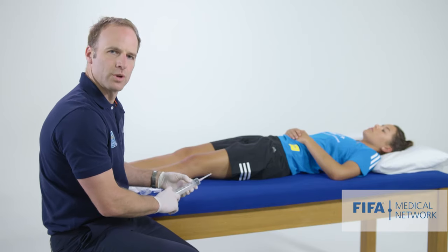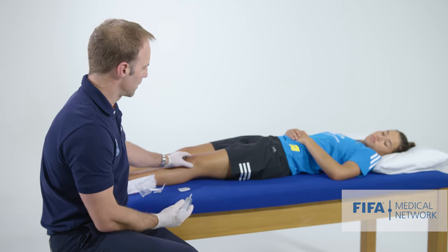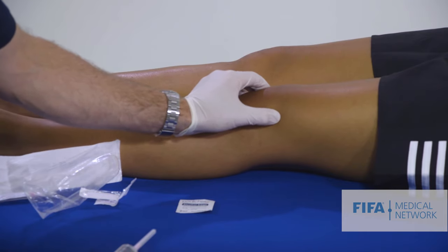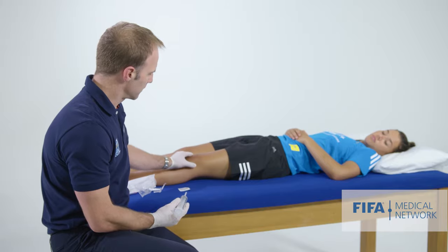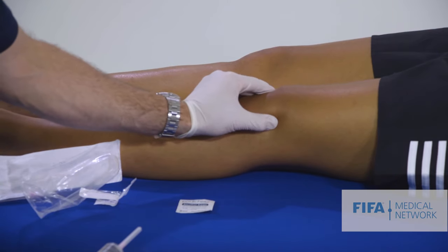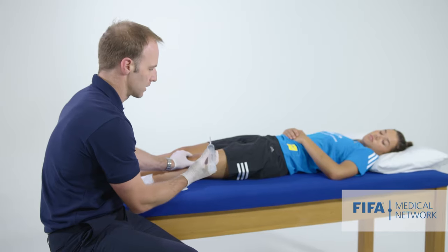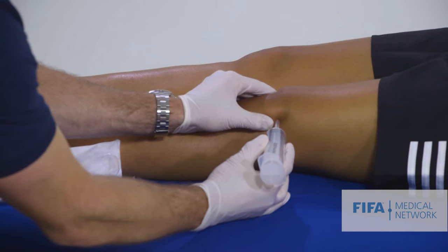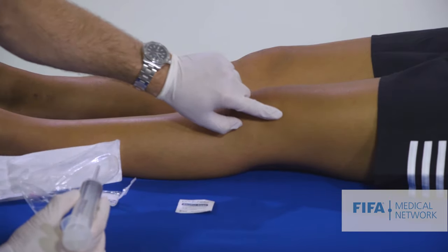When doing this, it's important to use a sterile no-touch technique. First, we want to identify where we're going. Palpating the patella, we want to go just superior and lateral to it. I use my fingers on the other hand to tilt the patella towards me, creating more potential space. Feeling just superior and lateral to the patella, I use the needle cap to make a mark to aim for, giving us a clearly marked target.